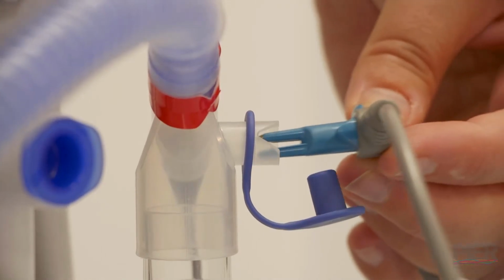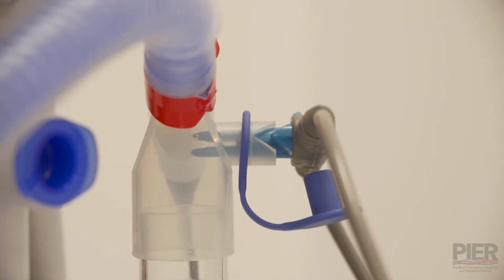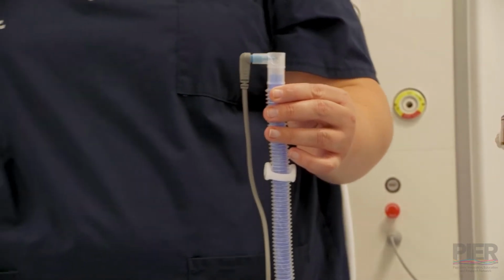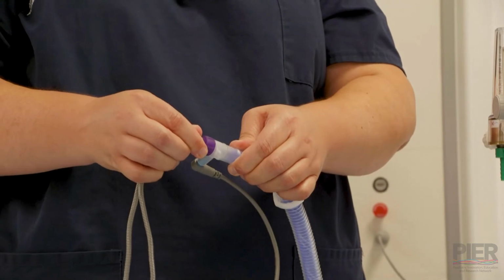First connector goes into the side. There's a small triangle that shows you where to line it up to. And then the top one comes up to the top of the circuit. This is where your prongs will attach, so please pick a set of prongs that are appropriately sized for your patient, and they just click in.